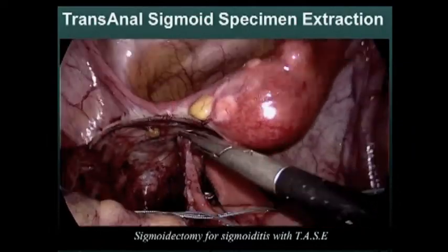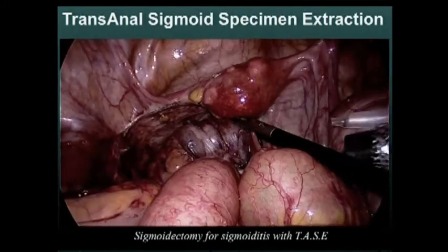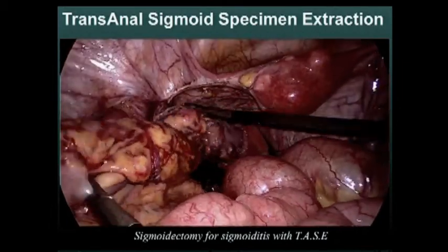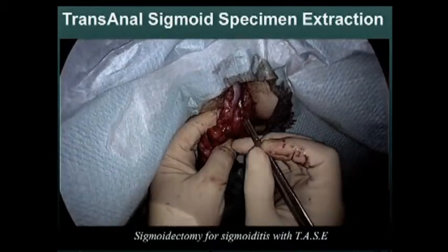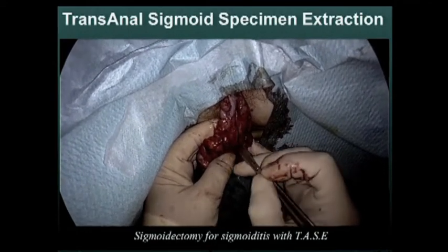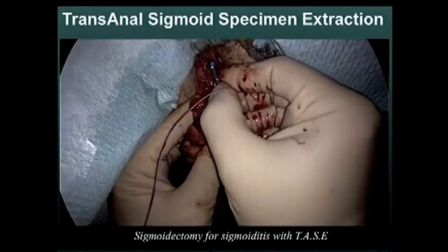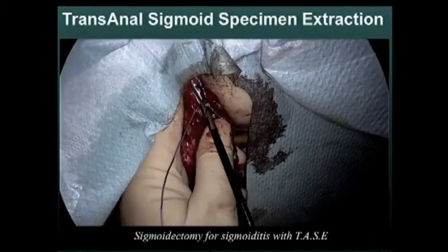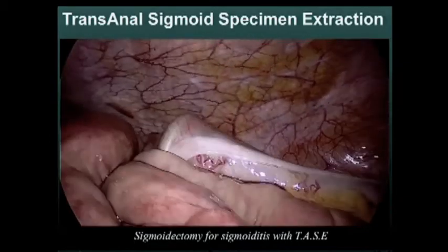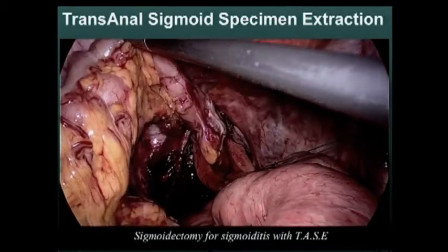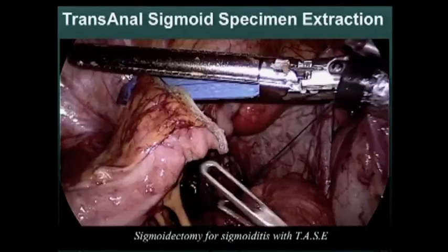We pull the sutures transanally without dilation of the sphincter. We are surprised because when we pull the specimen, there is a small resistance around the sphincter and then progressive dilation — as during defecation. We evert the stenotic part, enter inside the colon, and introduce the anvil connected to a suture — a large number-2 suture — and push the anvil into the proximal colon under laparoscopic control.